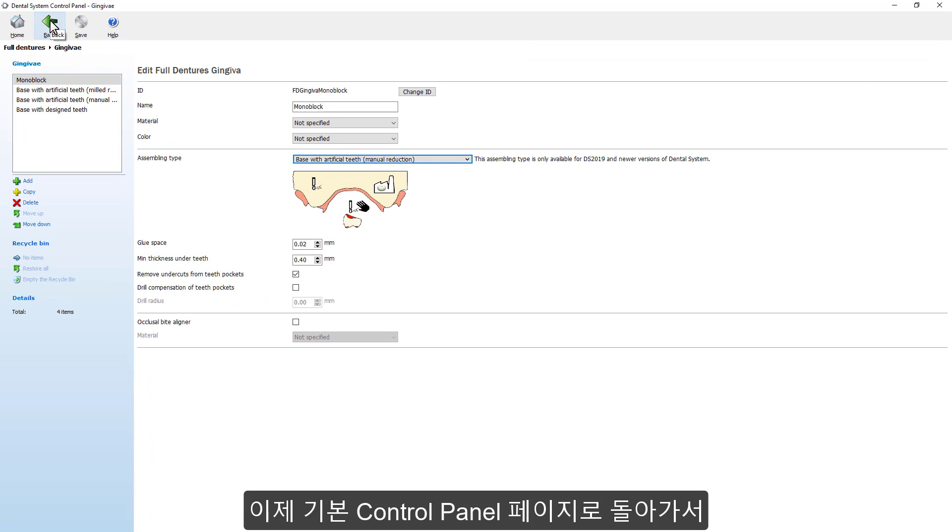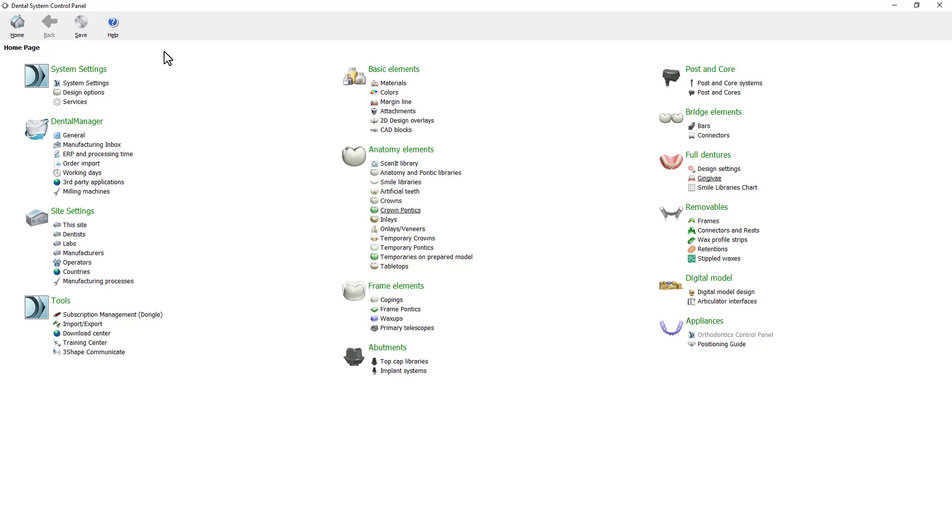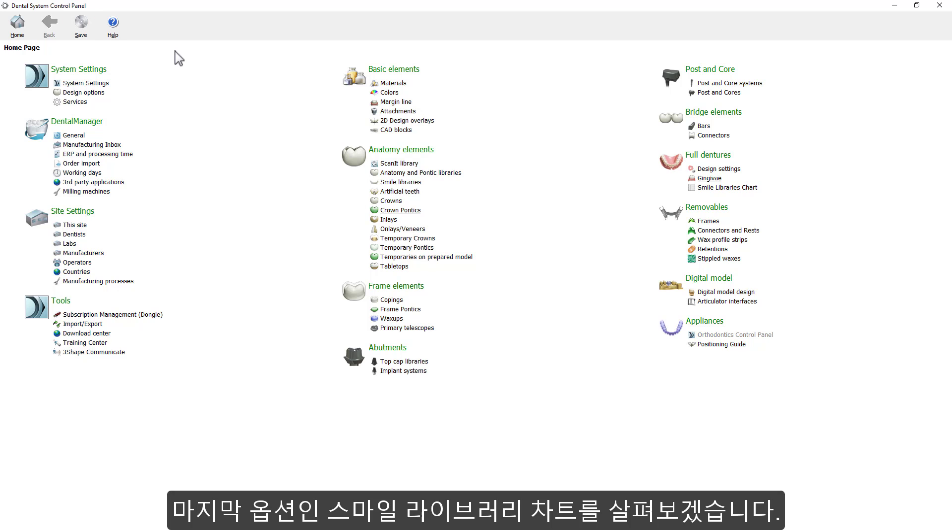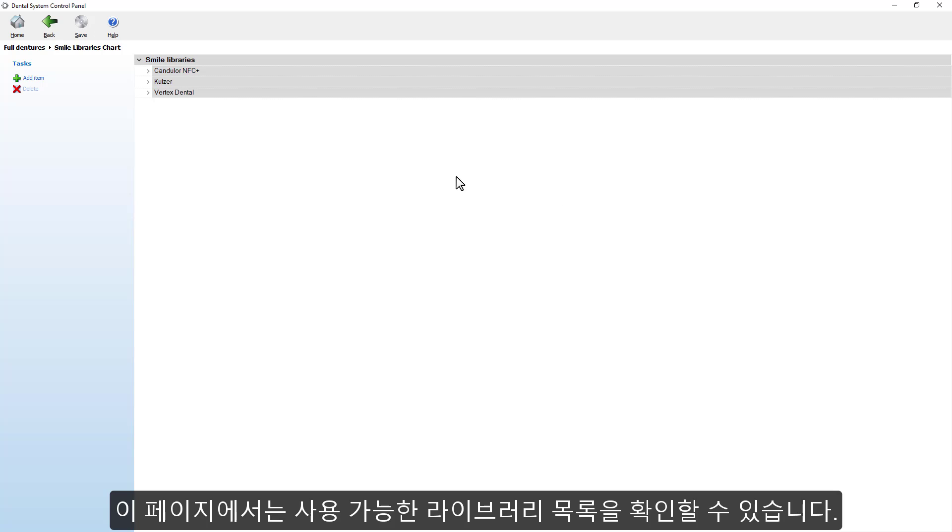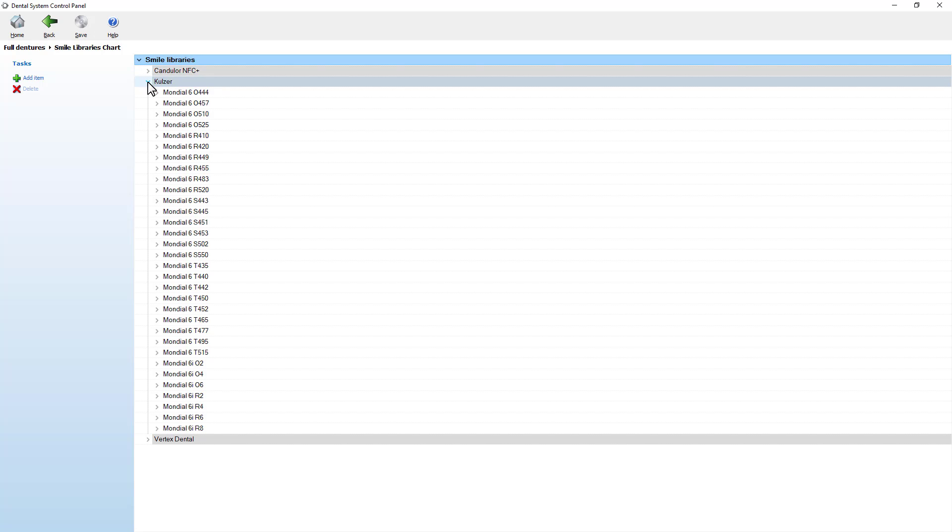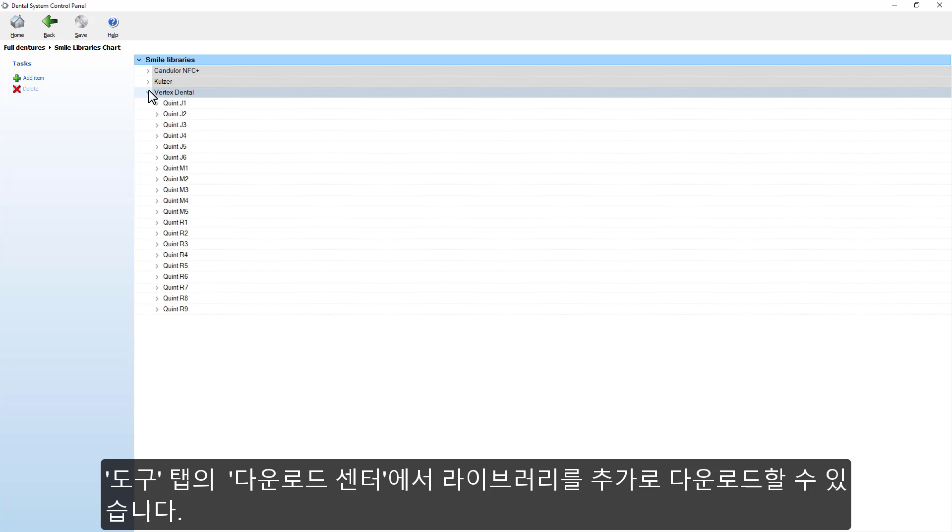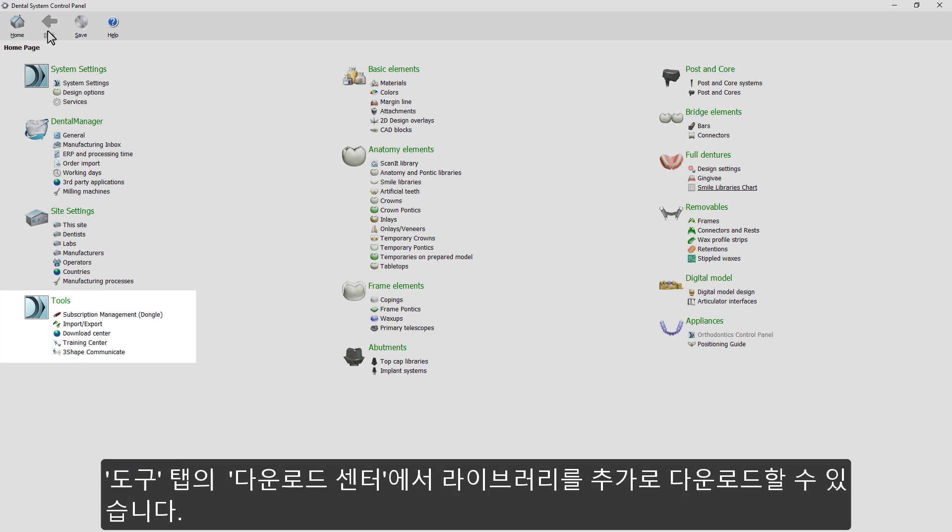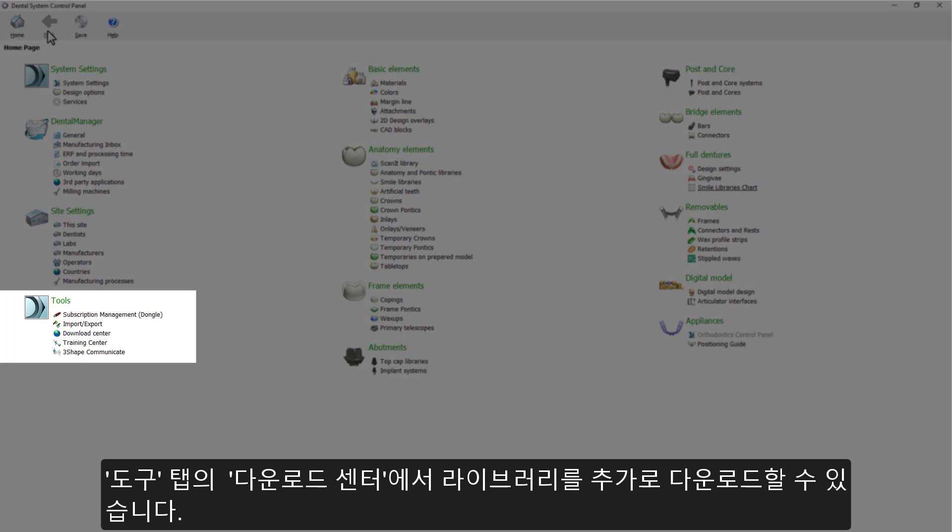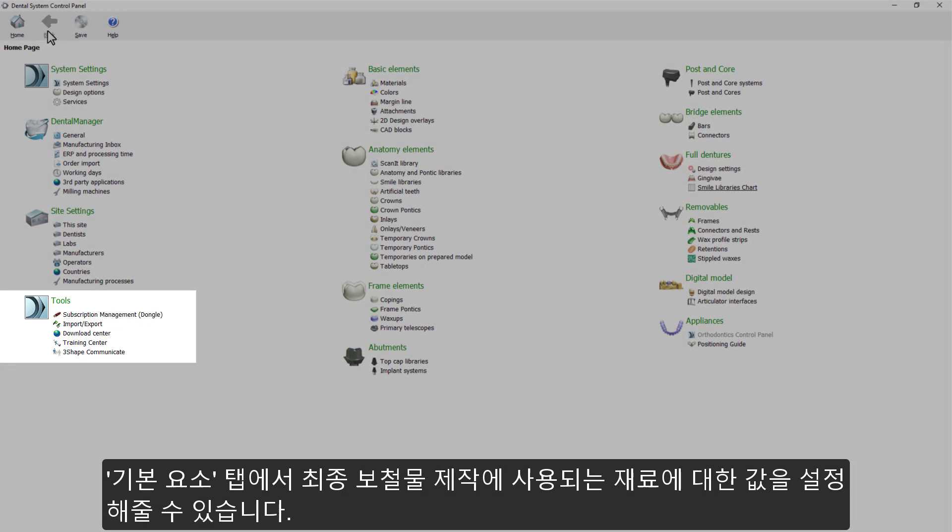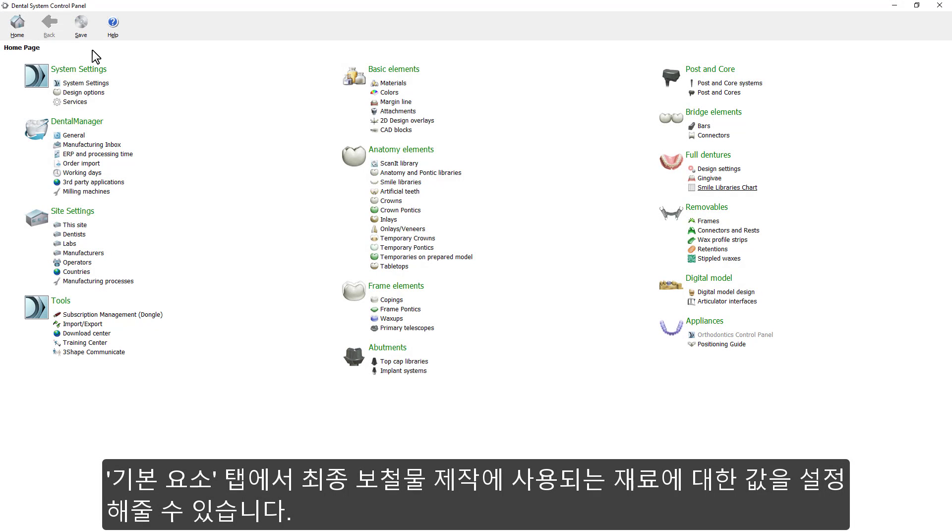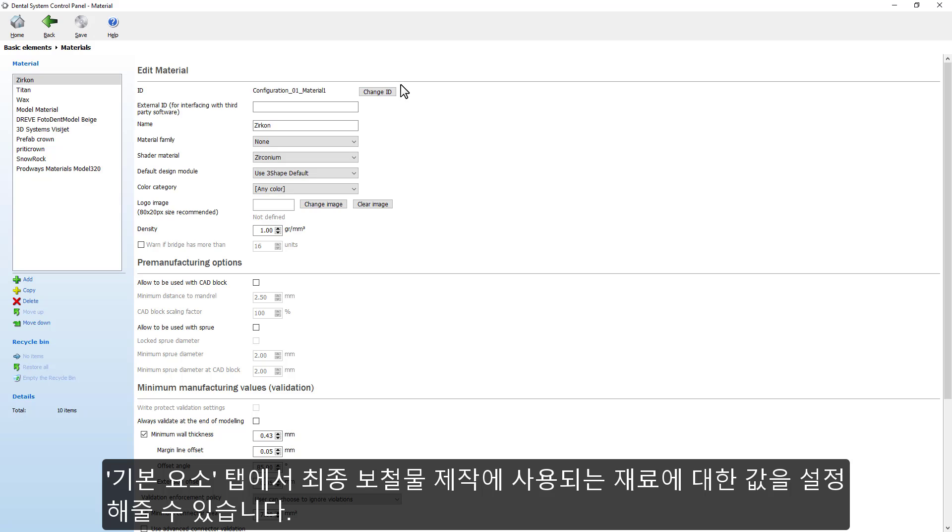Now go back to the main control panel page. The last option for the full denture is the Smile Libraries chart. In here, you will see the list of available libraries. To be able to download more, go to our Download Center in the Tools menu. You can also pre-define the material used for manufacturing the final restoration in the basic Elements options.